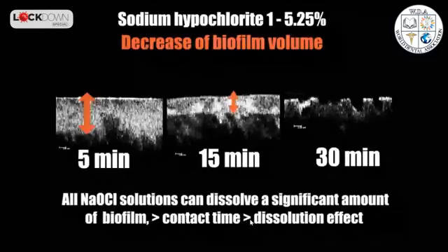You can observe that the more time the liquid is in contact, of course, you need to refresh the sodium hypochlorite every 5 minutes, the more the dissolution effect over the biofilm increases. So it is basically just a matter of time.